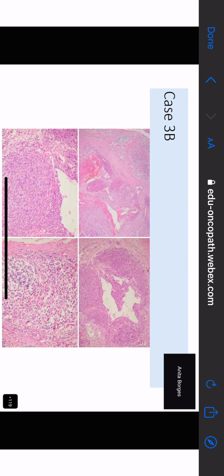Nodular soft tissue lesion, which is recurrent, with minimal pleomorphism, surrounded by... Somebody must be saying something in the chat box. What is in the chat box? What's the diagnosis? No response so far, ma'am. Nobody so far. I think they've all gone to sleep. Deepa, what's the diagnosis?